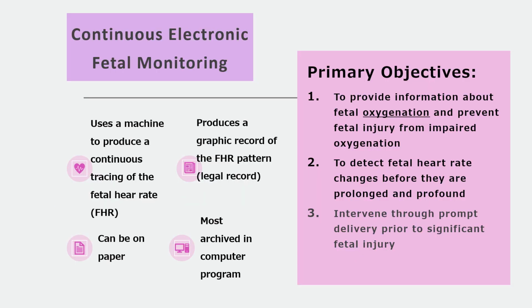Okay, so what are our goals? Okay, we talked about on the left all that information there regarding what the monitor does. Now, the primary objectives. So this is really important to remember, these three things. Okay, so provide information about fetal oxygenation. As you can see there, I have oxygenation underlined. I'm going to talk about oxygenation a lot because that's what we're concerned with. This is how we tell if there's fetal well-being.